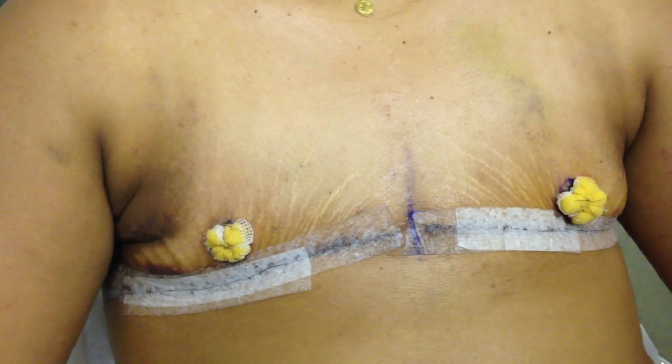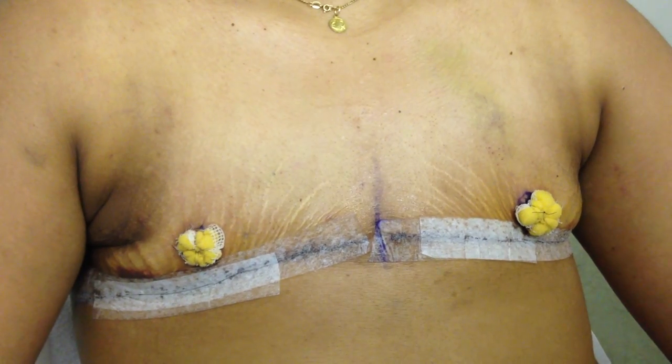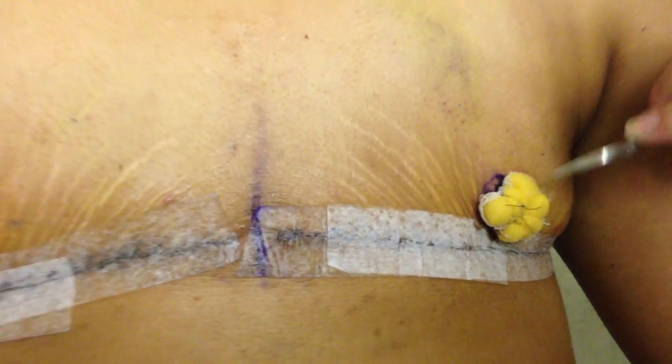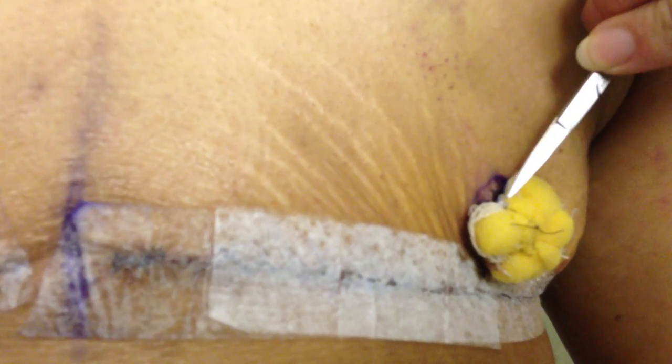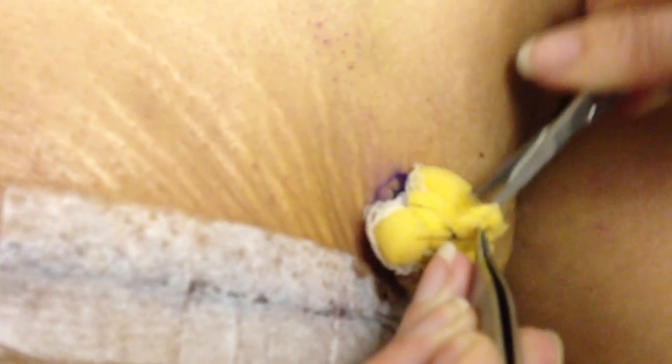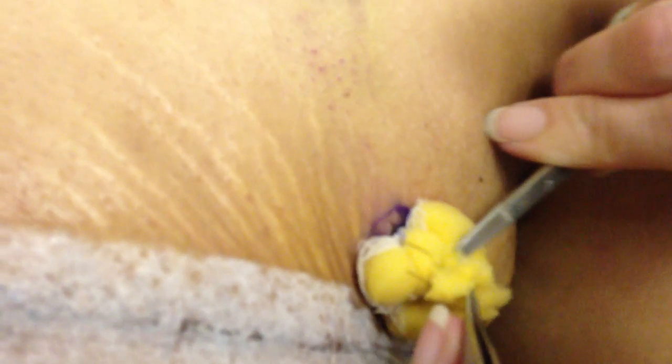So first thing we're going to do is take down the graft. As you can see, the stitches are sewn just around the graft here, right through the graft and around the sponges. So instead of cutting down at the base, all we're going to do is cut through the sponge and it releases all the stitches that are holding it in place.